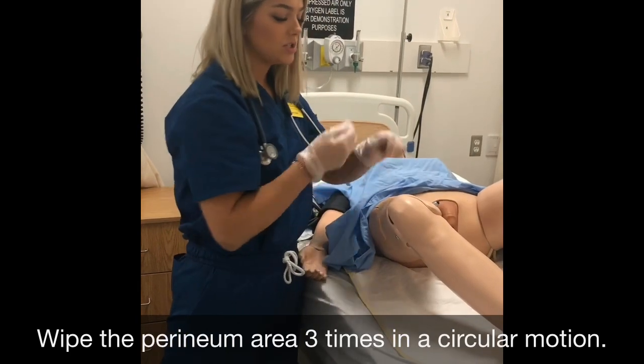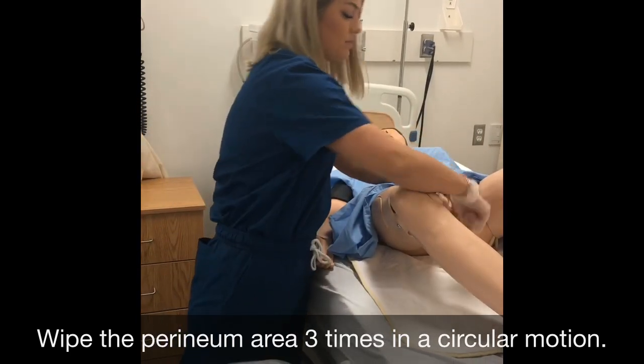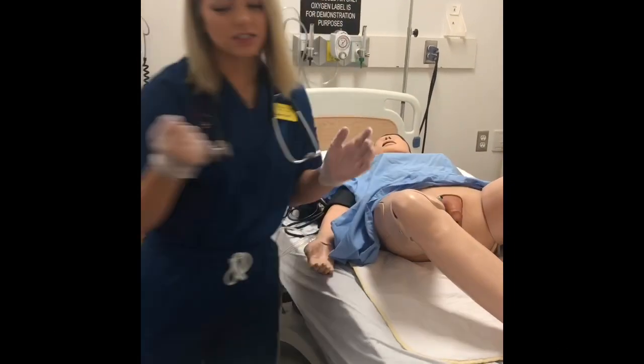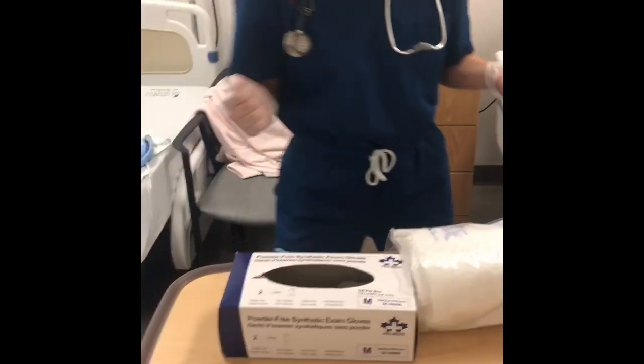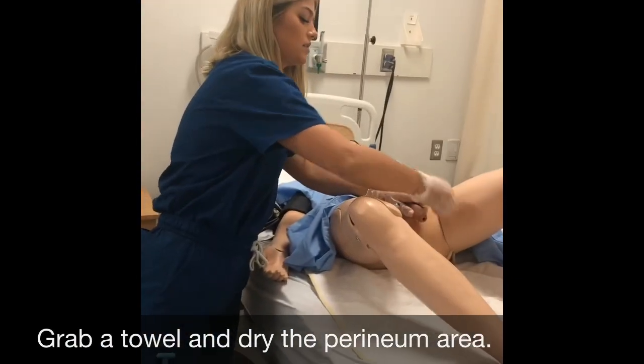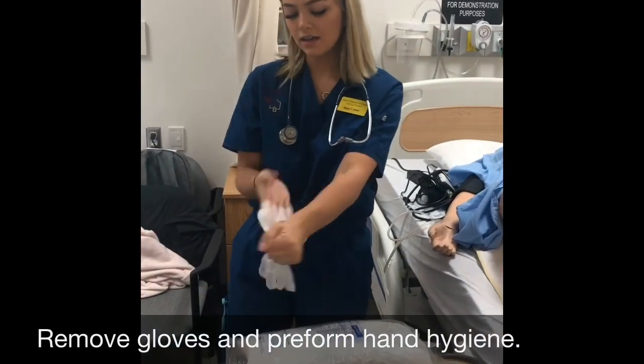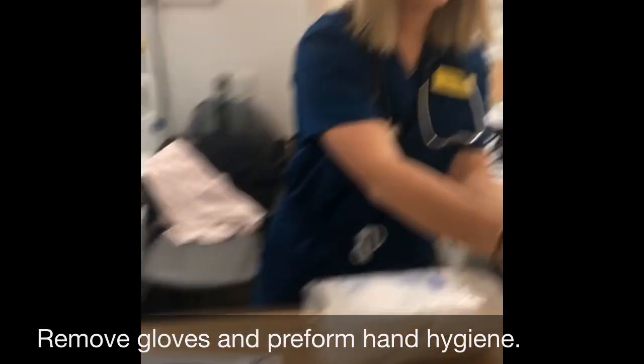And I'm just gonna ensure to change the side of the wipe I use each time. I'm gonna dispose of that wipe in the trash, and I would get a towel and I would dry the perineal area off. Okay. So now I'm just gonna remove my gloves and I'm gonna perform hand hygiene.